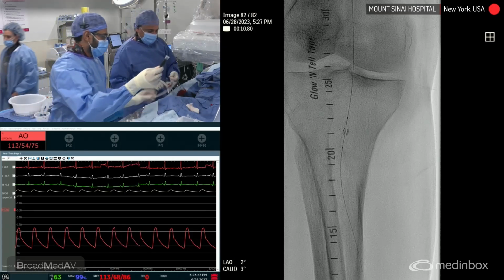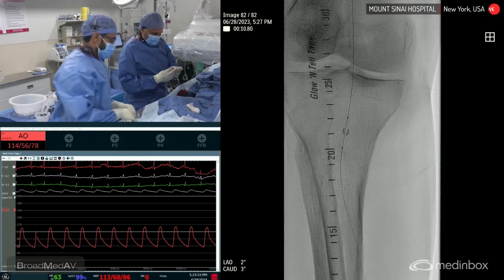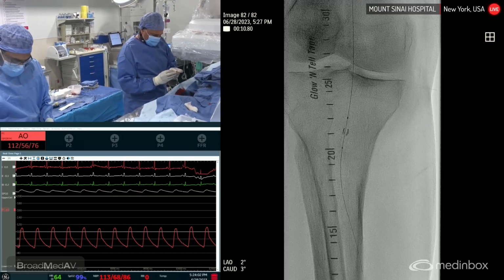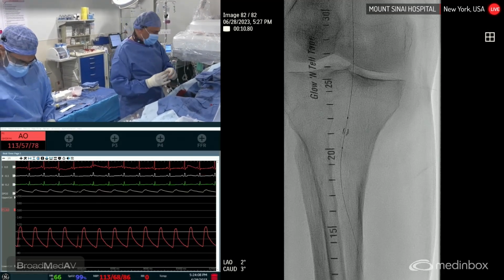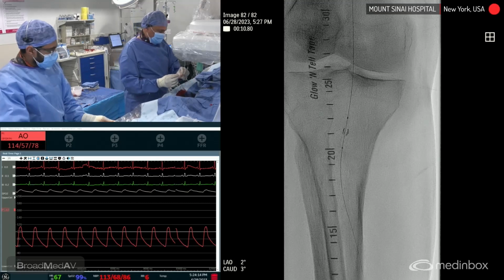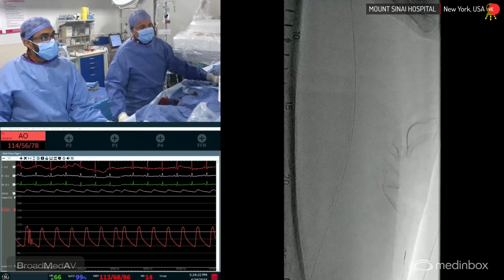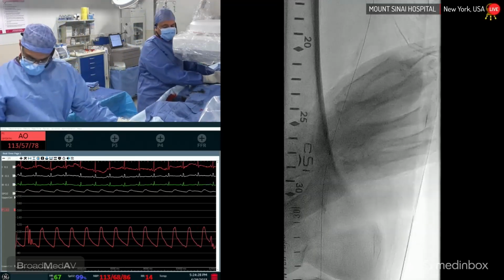So we have an 018 Philips IVUS. And the reason we do these IVUSs, again, is to look at the morphology of the lesion to help plan our sizing as well as our atherectomy device, whether there's a heavy calcium that may mean we need a shock wave or some sort of calcium management device. We also do IVUS. IVUS has been shown in our personal data from Sinai with over 500 patients that in mal-deployed stents, especially the biomimetic stents with Supera, IVUS sizing definitely seems to help with the outcomes of Supera stenting. So clearly, there is a good role for IVUS in endovascular, although the outcomes have not really been studied.